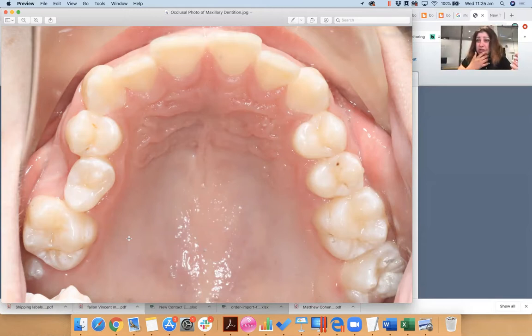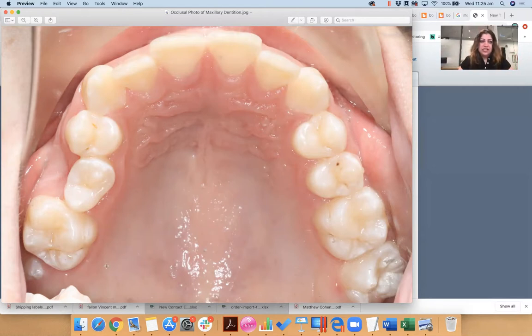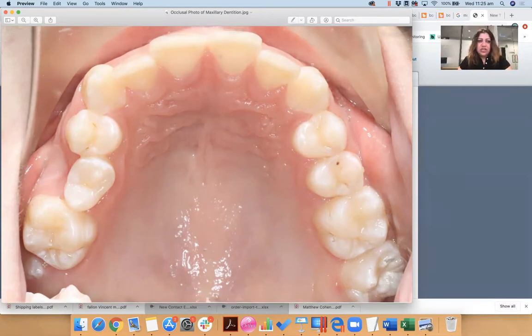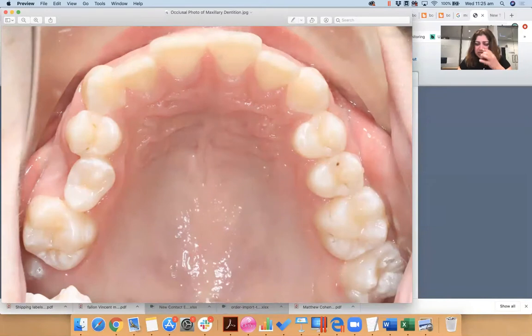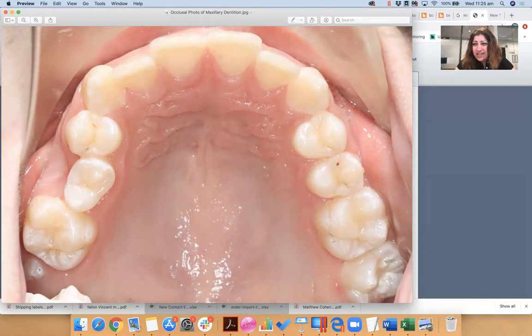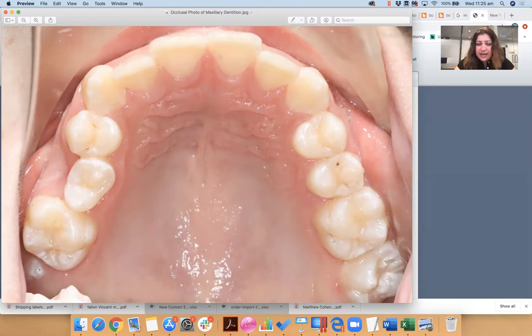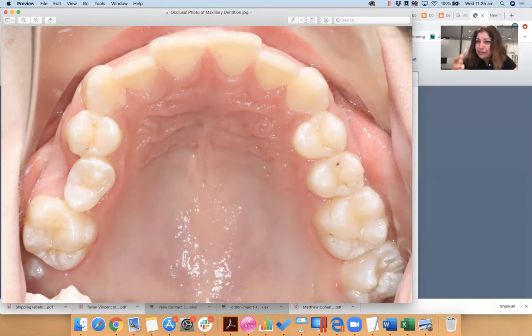Crowding is relatively mild, so we'll use a tiny bit of incisor proclination, tiny bit of expansion, derotation of premolar to gain the space to maintain, to give him the correct aesthetics for his incisor crowding. You can see the 1-7 is just about erupting, so obviously, even though with Insignia I've ordered customized brackets, there's no way Insignia can supply me a 1-7 customized bracket because it hasn't even erupted.